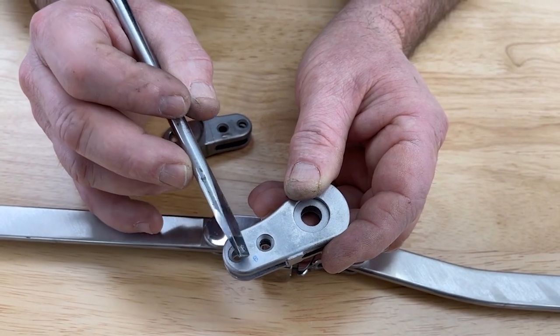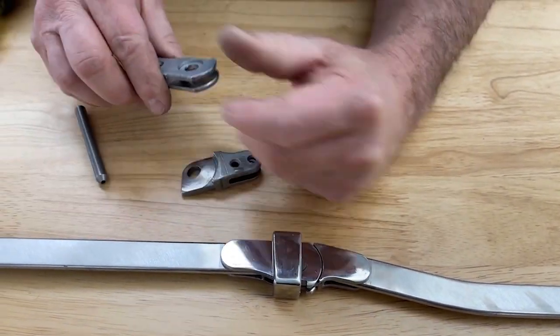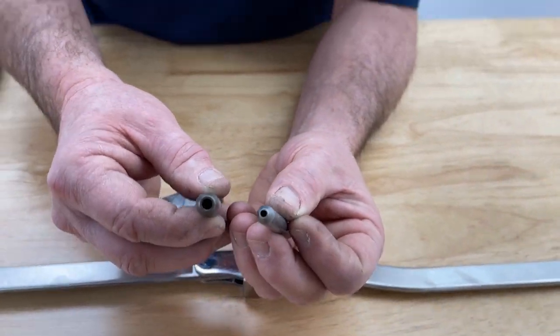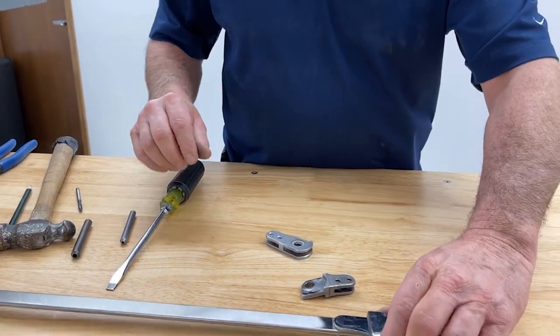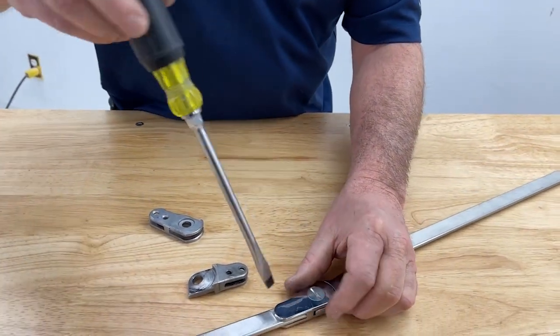So this is the placement of it. We're going to go ahead and install one in here. We're going to use the large ball bearings and the corking tools that are sold by Becker Orthopedic. I'm going to disassemble this — it's not required, but it's easier to handle.